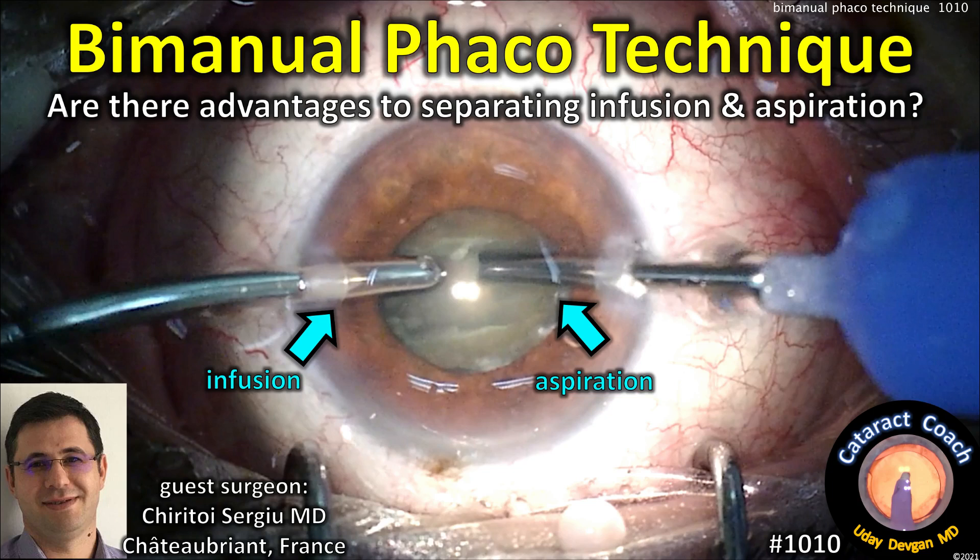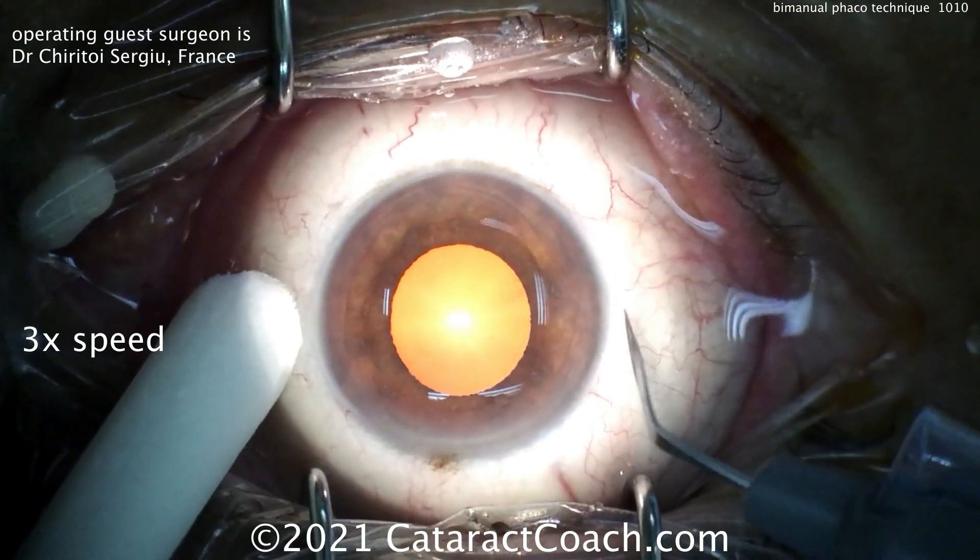CataractCoach.com. Bimanual phaco technique, are there advantages to separating the infusion from the aspiration? Our guest surgeon is Dr. Sergiu from France.